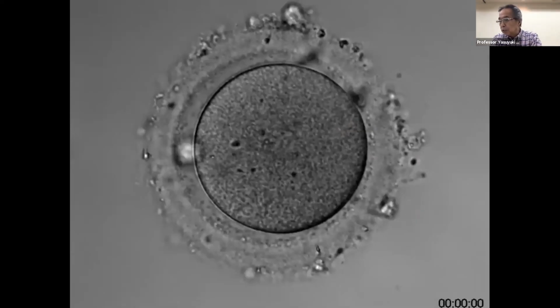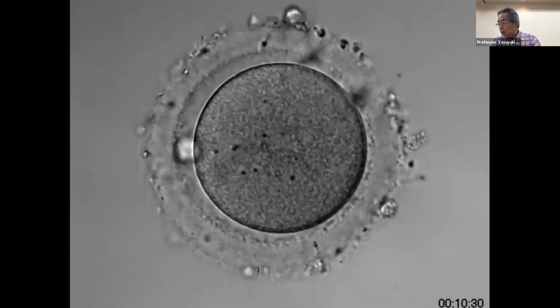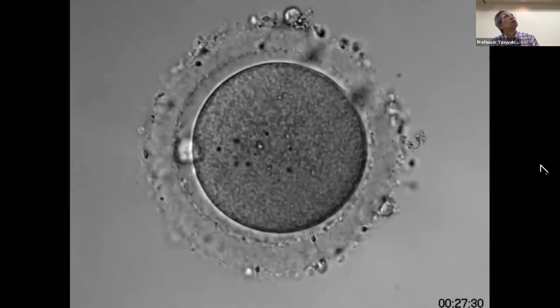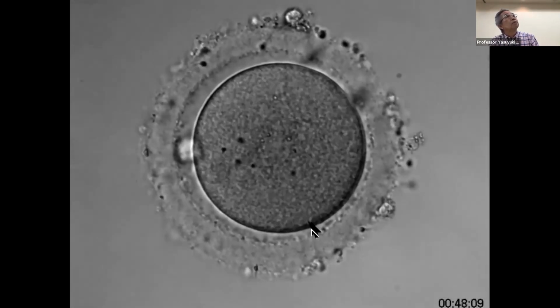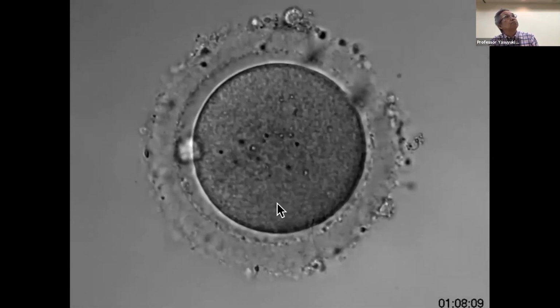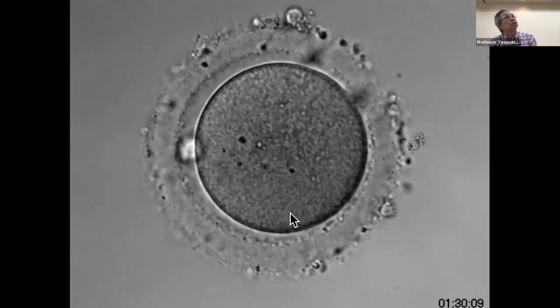This is the first movie taken by our time-lapse system. You can see the whole process from fertilization to second cleavage in a human oocyte. A sperm located at the 5 o'clock attached to the oocyte membrane. 40 minutes later, it fused into the ooplasm, and the second polar body is here, and the fertilization cone is here.